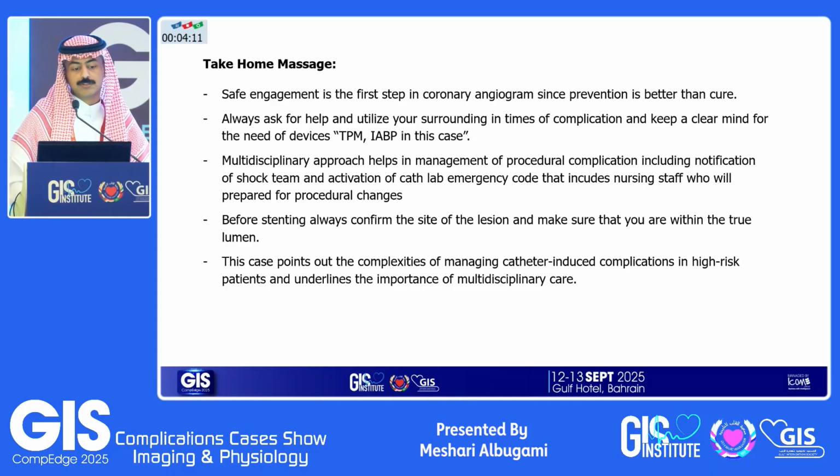So, take-home messages: as mentioned earlier, coaxiality is an important step. Safe engagement is the first step in coronary angiogram. Since prevention is better than cure, always ask for help and utilize your surroundings in times of complication, and keep a clear mind for the need for devices: intra-aortic balloon, IVUS, and TPM.